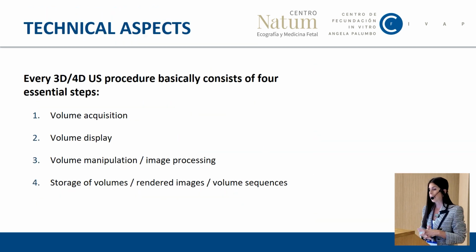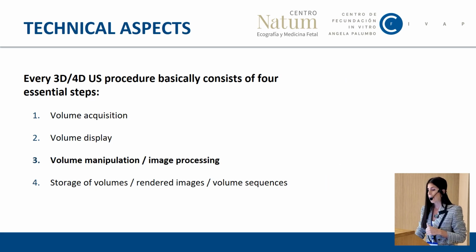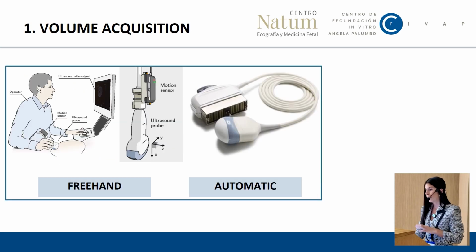So regarding technical aspects, every 3D and 4D ultrasound procedure basically consists of four essential steps: the volume acquisition, the volume display, the volume manipulation and processing, and the storage. I'm going to talk about those four steps. First of all, the volume acquisition.